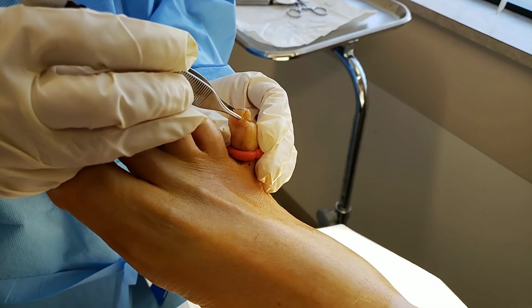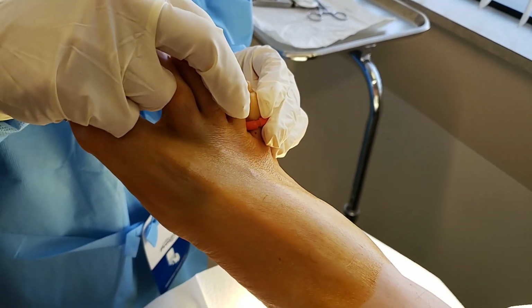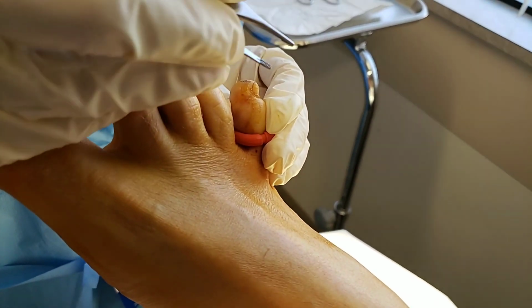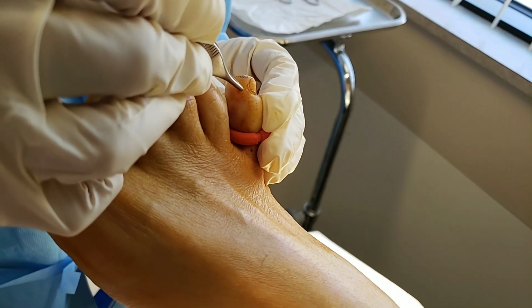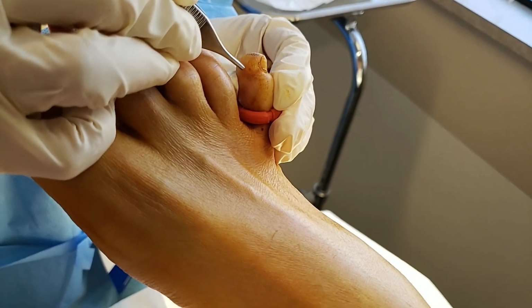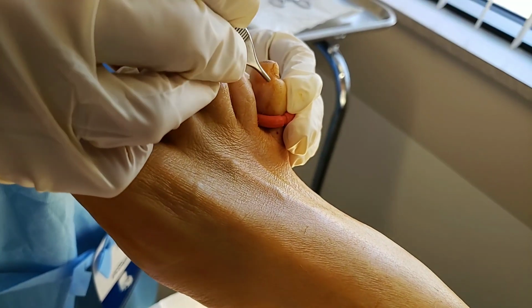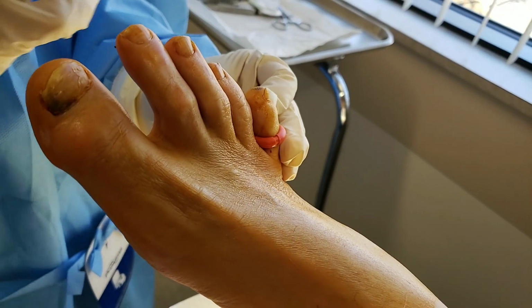Dr. Pelto here, I have a patient. He has a really painful corn between the toe. What's happening is this fifth toe is rubbing against the fourth toe, and it creates this painful callus that's underneath there. And it's been there for years, and it's bothersome. You trim it down and it comes back. So I've already numbed up the toe, that's why it doesn't hurt. And so we're going to explain kind of the treatment for this.